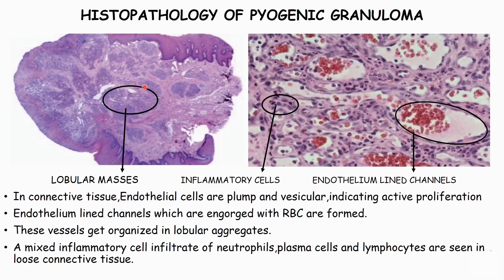These vessels get organized in lobular aggregates. A mixed inflammatory cell infiltrate of neutrophils, macrophages, and lymphocytes is evident in the loose connective tissue.